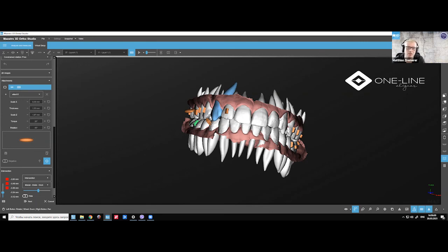0.75 foil? Yes, 0.75. And we use SDR from Dentsply. SDR is a bulk fill. It comes in capsules. Yes. So that's what we use for the attachments.